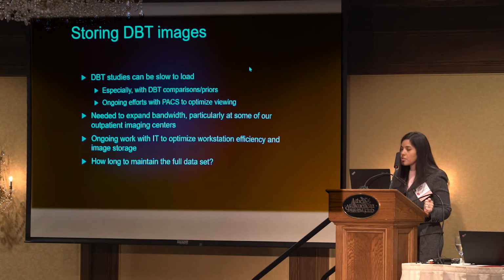We have had issues throughout our implementation with slow loading of these PACS studies. You sometimes need to expand your bandwidth.